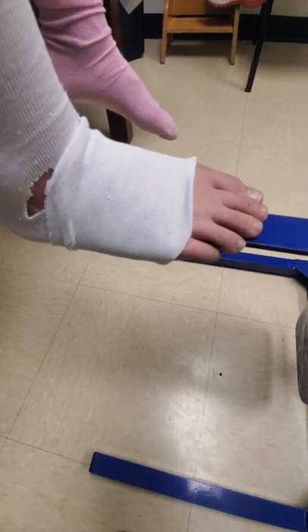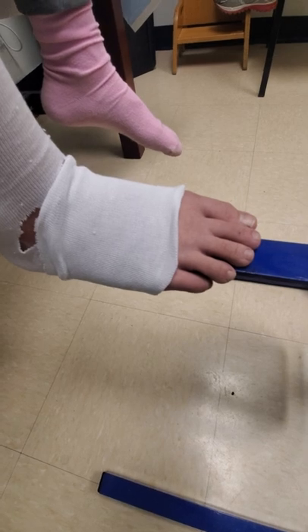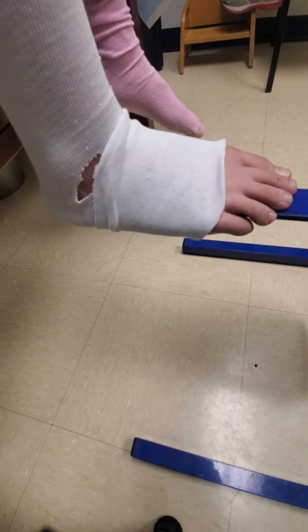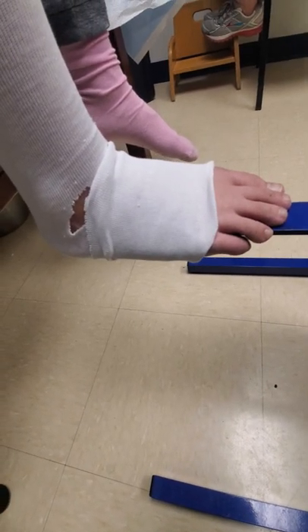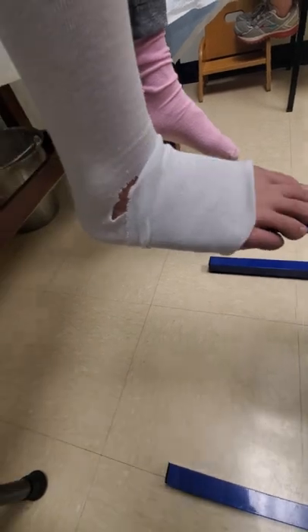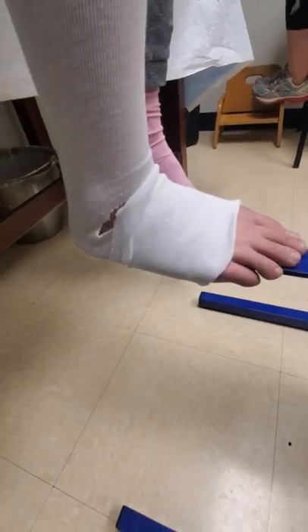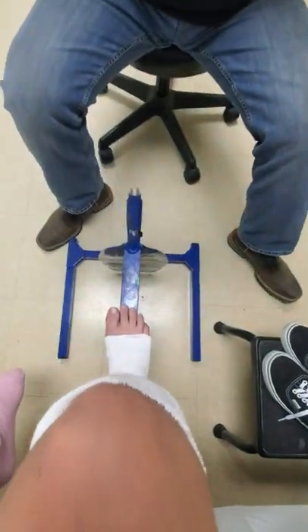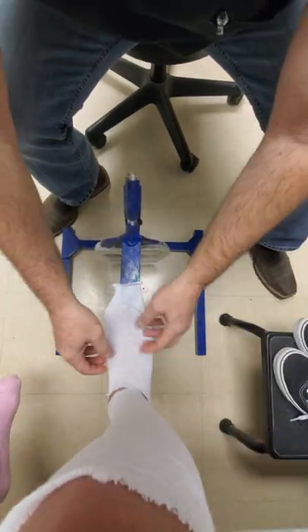I'm going to take the camera to show the right angle we're trying to achieve. This is a good demo because you can see the opposing foot — the good foot — has foot drop. Coming over to the cast stand side, we're actually about two degrees from a right angle. I'll adjust a little and have the patient lean their knee forward, and now we're at a really nice right angle. Then I'll hand it back and fold the sock over, and we'll progress onward with the padding.